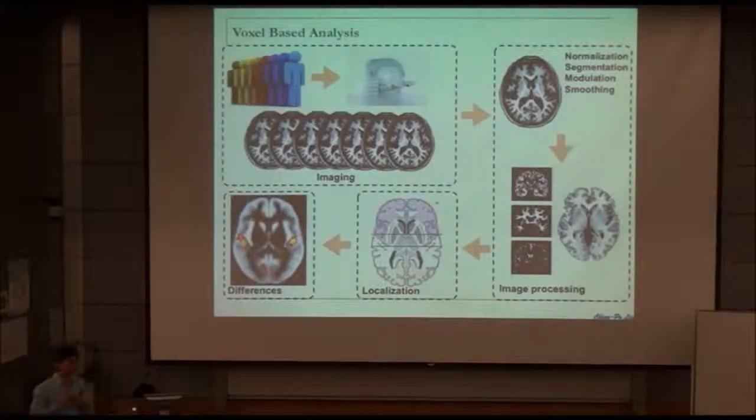Because, for example, if I am a healthy subject, then my brain is actually different from yours, all of you. I know most of you are healthy subjects, but our brains are actually different. So we can hardly use only one brain as the template. Do you know what I mean? Because the change belongs to gene differences, or is linked to your education or thinking process and so on. So the easier, more convincing way is to have such group analysis.